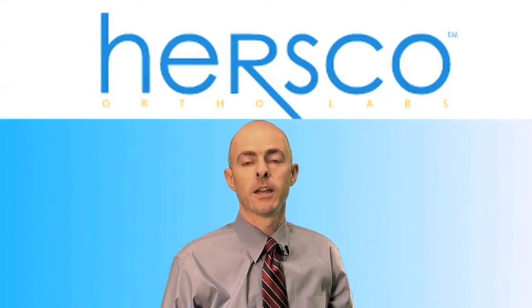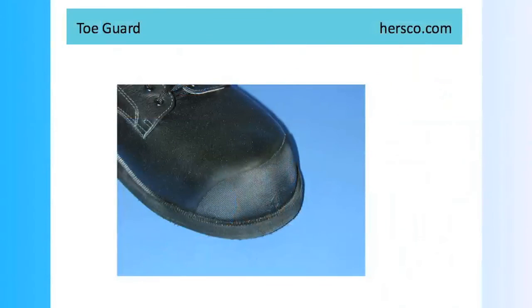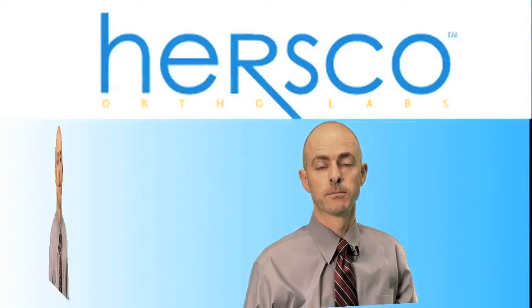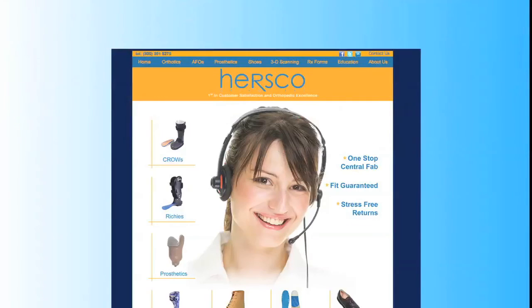Finally, in cases where a patient has drop foot or they tend to drag their foot, it's possible to add a toe guard to the shoe itself. This is a guard of a thin, harder plastic material that prevents the patient from scuffing the toes and sometimes even breaking through the upper leather so that the shoes last longer. These are some of the many modifications possible with regular store-bought shoes.